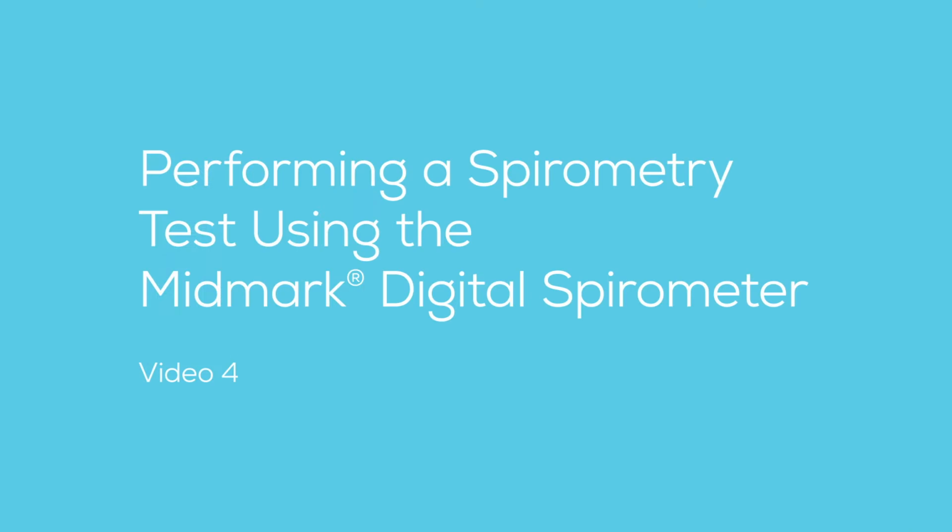This video is the fourth in a series of 6 videos created to provide an overview of the Midmark digital spirometer. This video will guide you through performing a spirometry test.